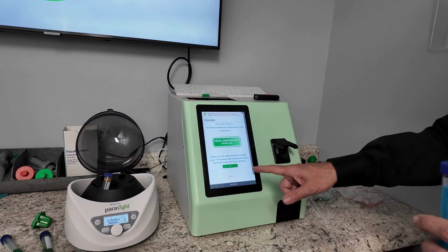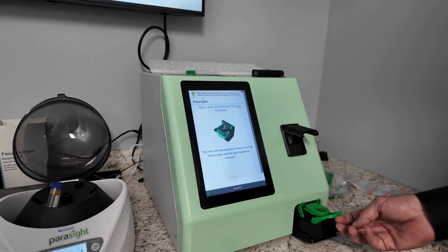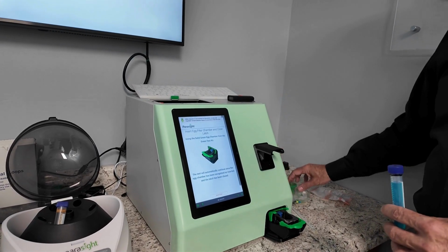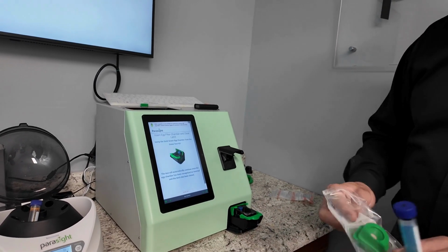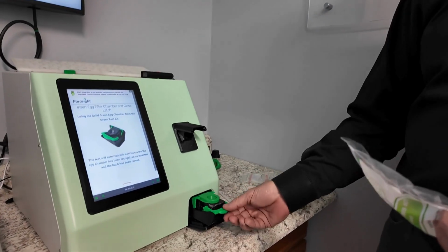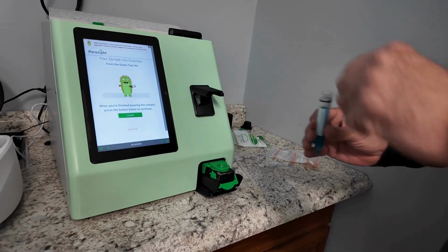Now Parasight tells us what to do. Yes, we did use the green test kit. It comes out. We're going to go ahead and put away the unit from before, and we're going to put in the new egg chamber. Put the egg chamber in. Let's set that down. Now Parasight tells us to go ahead and pour in the amount.